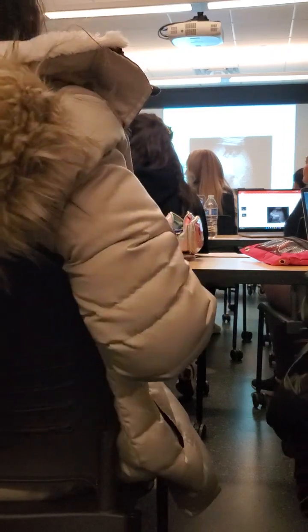So this will be a newer infarct. You can kind of see there are some areas of calcification beginning, kind of right in here. But eventually, this will all get very hyperechoic and have areas of calcification.